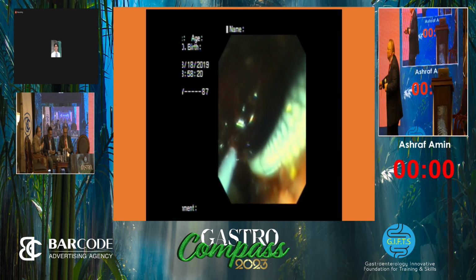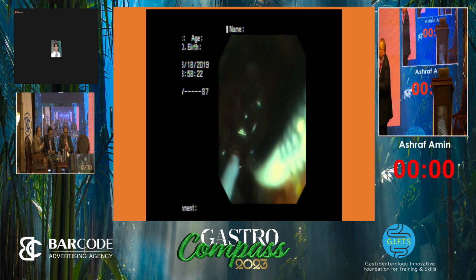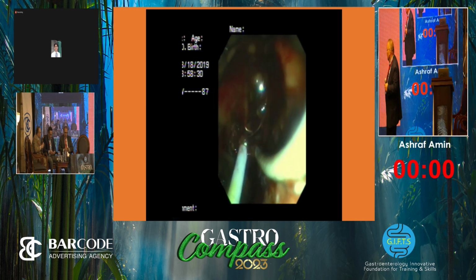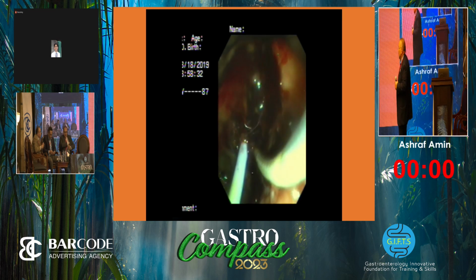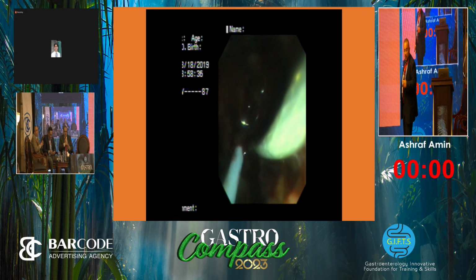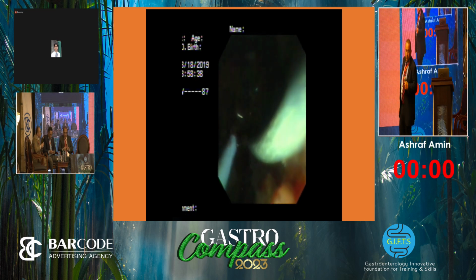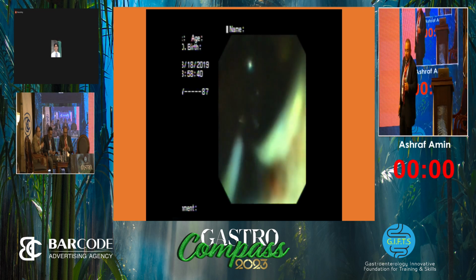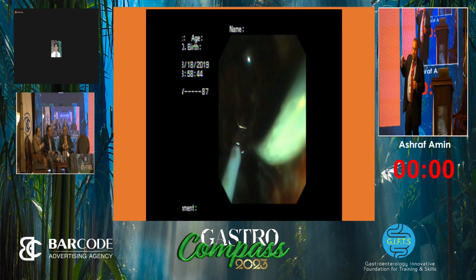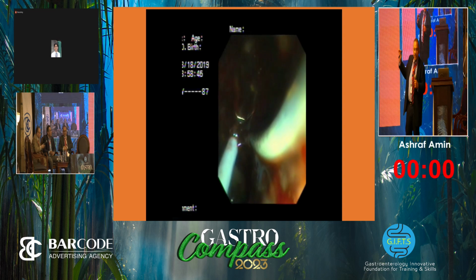I did not remove the plastic stent. I removed it at the last step because this makes the access easier for me. So I can see the metallic stent and I can put the wire easily. I don't remember, but maybe it was partially covered. I removed it with a snare. It was easier. Yes, it was impacted, but easier to remove with the snare.